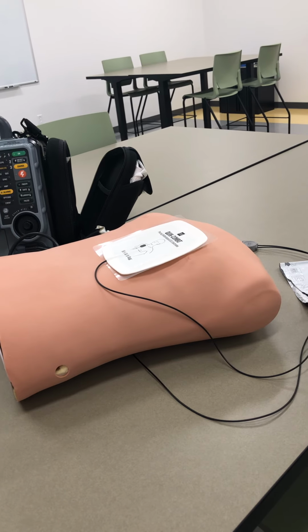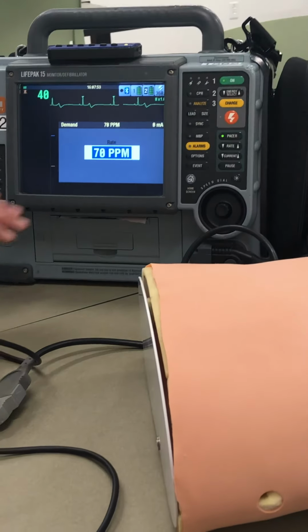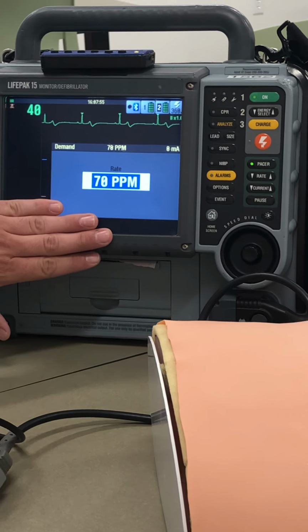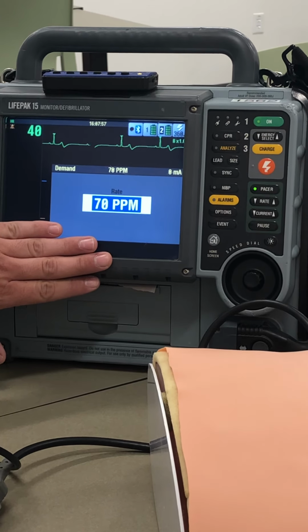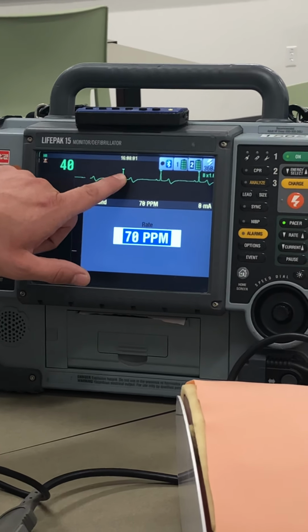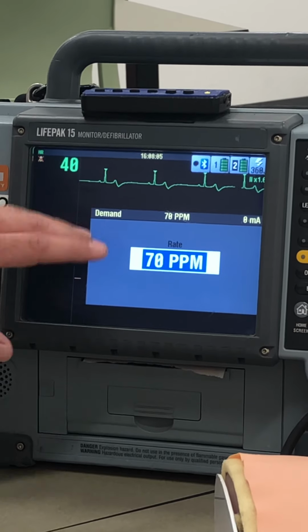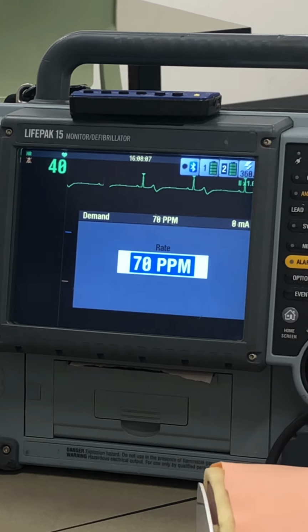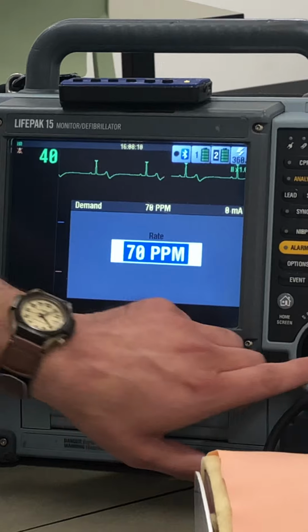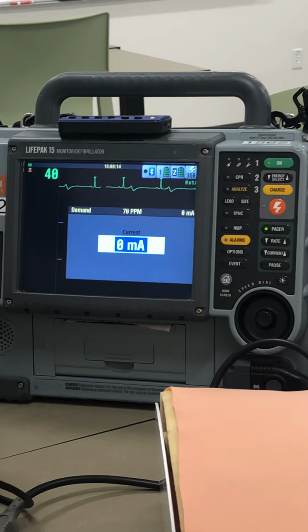Once we have done that, we're going to click pacer on your monitor. Most monitors will be preset at a predetermined rate. Ours is set at 70 pulses per minute. You're going to note the triangles, which are sensing markers. You want them to be over the QRS. If they're on any other waveform, you want to try and reset and troubleshoot. Once you have that, you set the rate, and now we're going to set the milliamps.